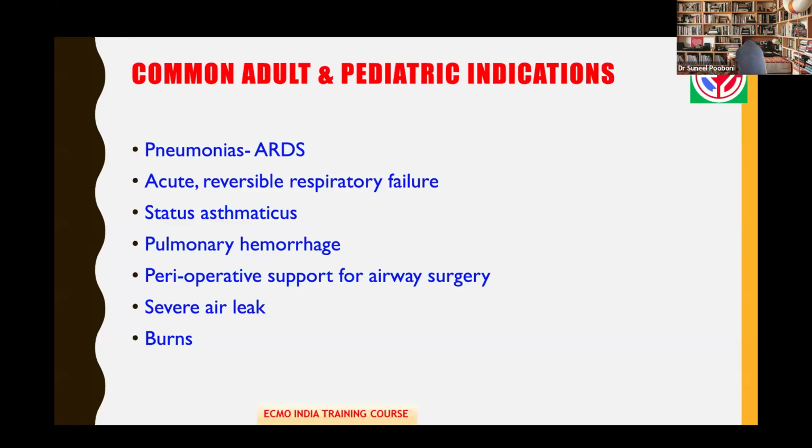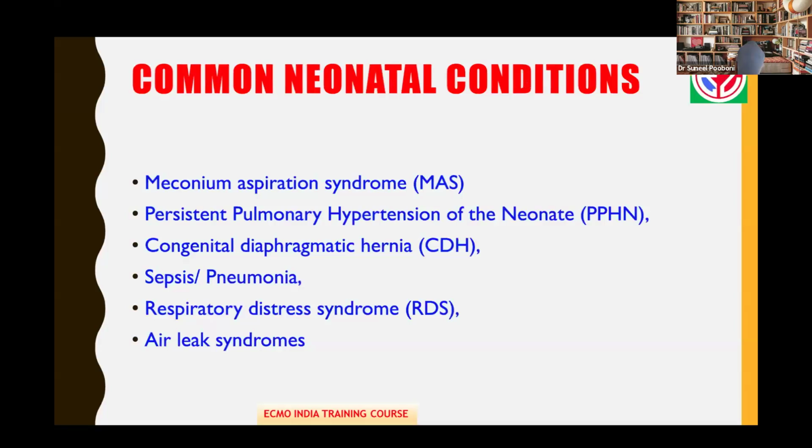Pulmonary hemorrhage can be a complication. Perioperative support for airway surgery and severe air leaks, burns, etc. These are all indications for ECMO. Burns means respiratory burns.